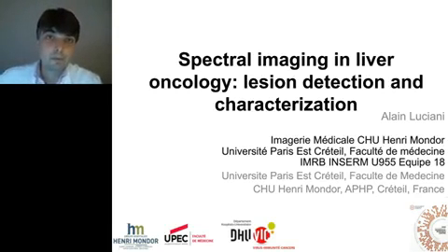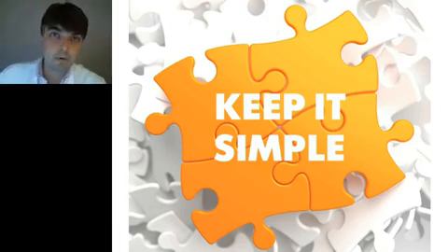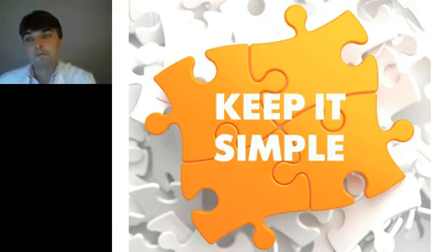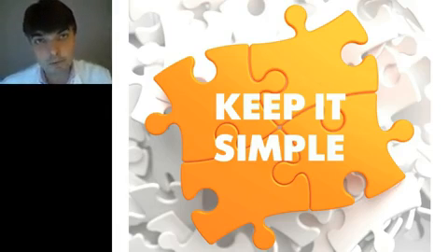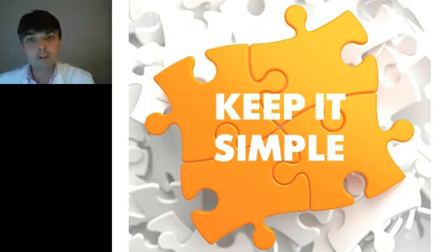To start with, we could detail what the potentials of spectral imaging actually are. I have one keyword: we have to keep it simple. If we want to use spectral imaging in clinical practice, we have to demonstrate first that it's kind of simple, and that means understanding the basic principles underlying spectral imaging. For that, I will only show three technical slides. Those are the only slides a little bit complicated, and the rest should be very easy and straightforward.